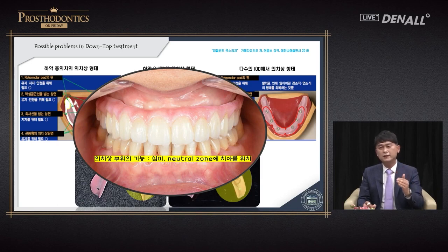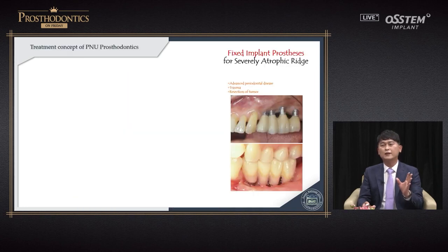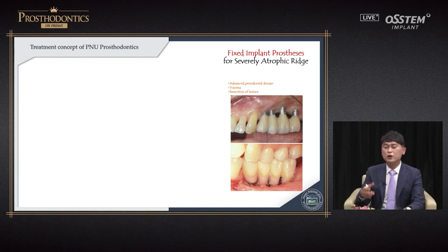Fracture or other problems. I want to emphasize today that the denture base is for aesthetics and positioning of teeth in the neutral zone and for ease of cleaning. I want to emphasize that this is not absolutely 100% right. We can use it in this case.